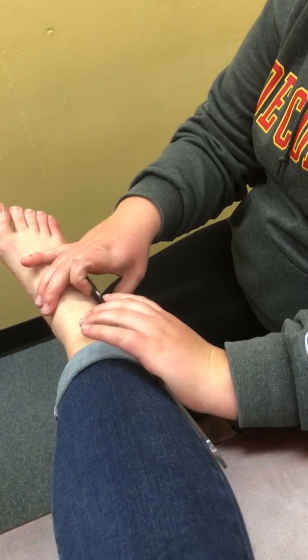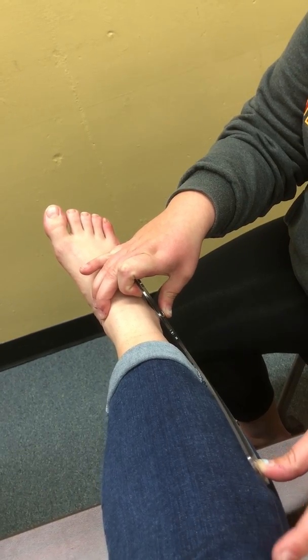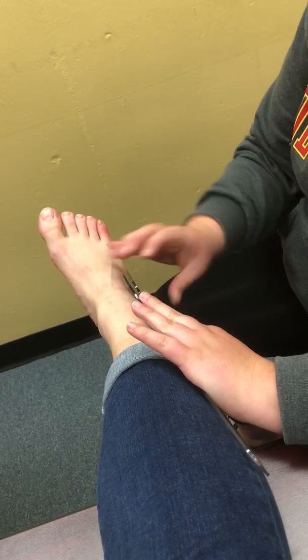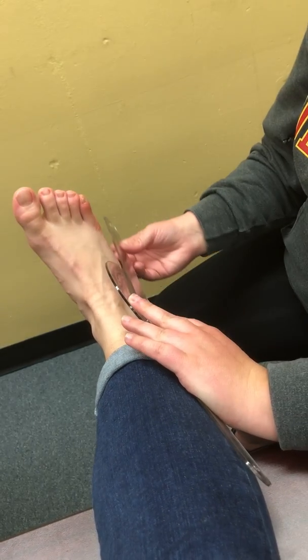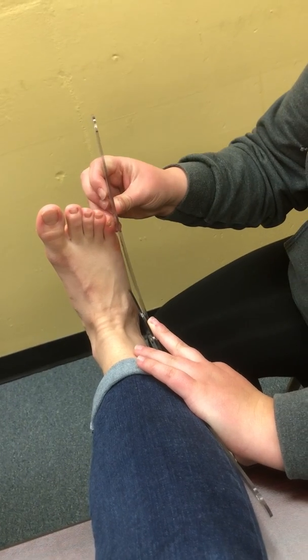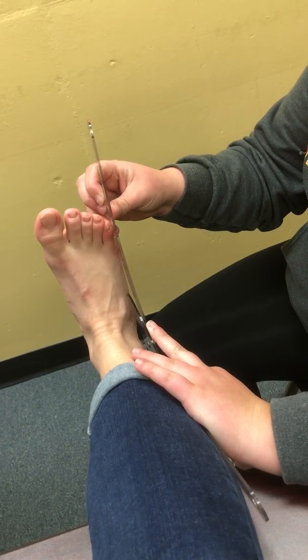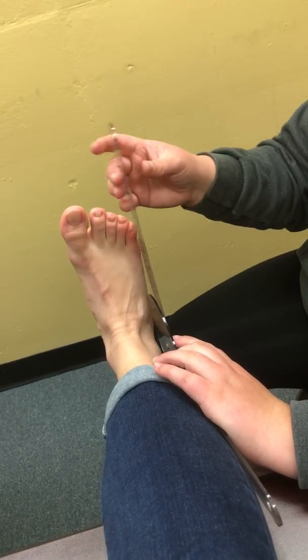I'm going to be doing active range of motion with the goniometer, lining this up. I'm going to have you do dorsiflexion first, so bring your toes towards you. Active range of motion for dorsiflexion is 20 degrees.